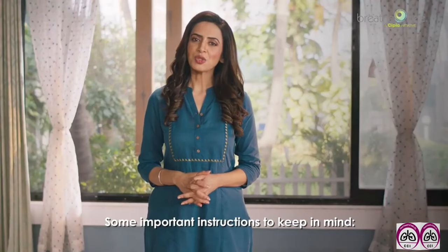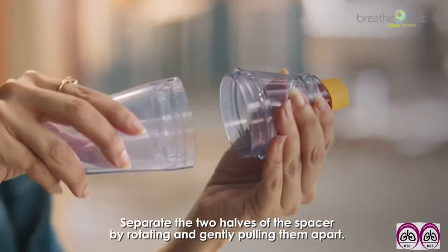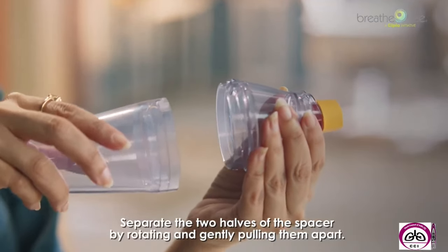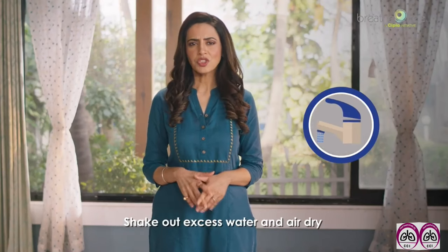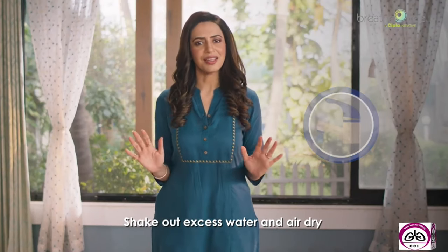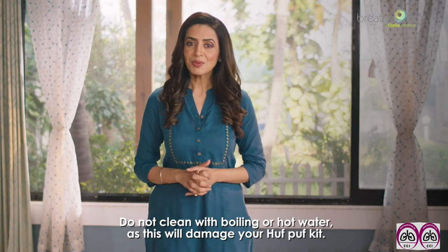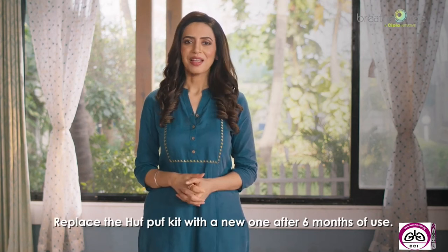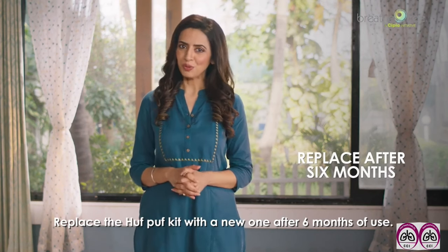Some important instructions to keep in mind. Clean the Huff Puff kit at least once a week. Separate the two halves of the spacer by rotating and gently pulling them apart. Rinse both halves in clean running water. Shake out excess water and air dry. Do not clean with boiling or hot water as this will damage your Huff Puff kit. Replace the Huff Puff kit with a new one after 6 months of use.